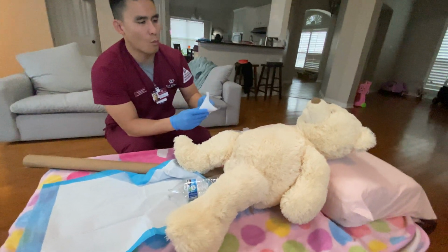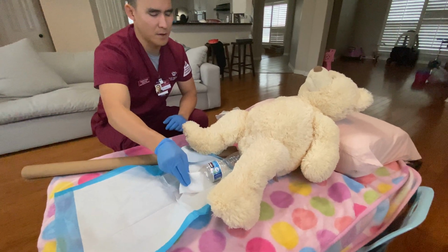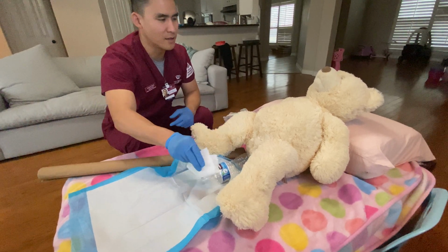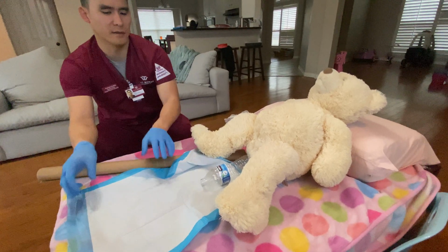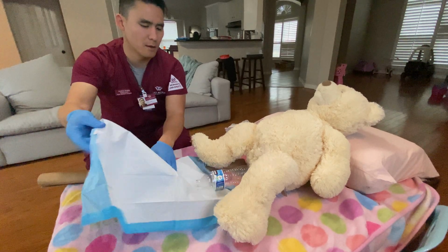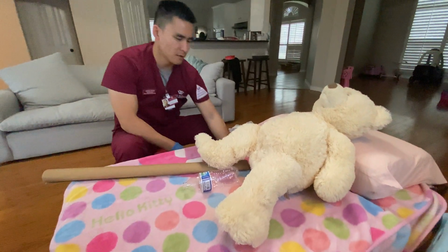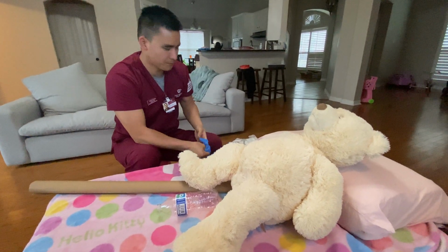So now I'm going to wipe your perineal area on the penis, tip of the penis shaft, and go down. And again, I'm going to wipe your penis tip and go down the shaft. And it's okay to let this air dry, so we'll give you some time there, but in the meantime I will clean up and remove the waterproof pad. And remove my now dirty gloves.